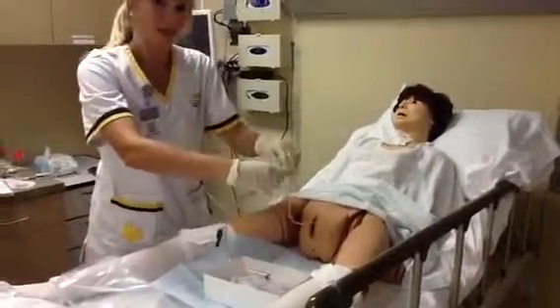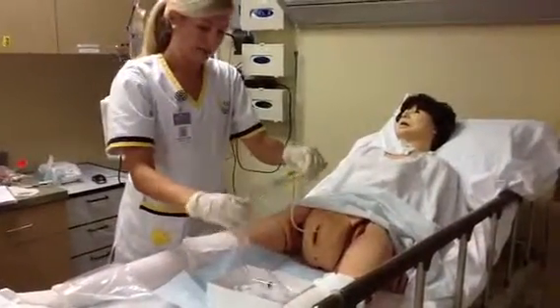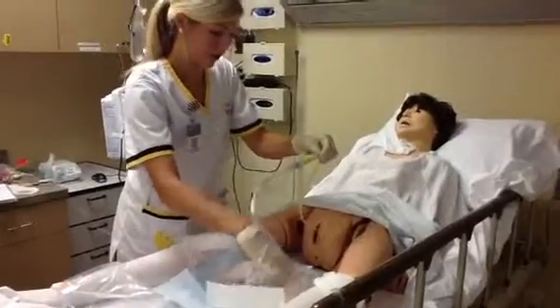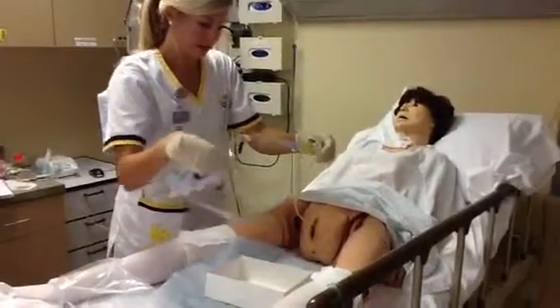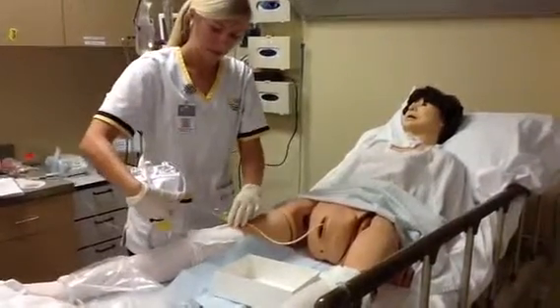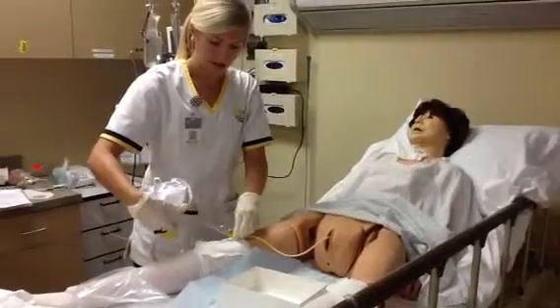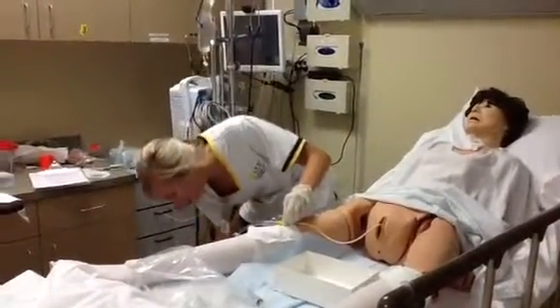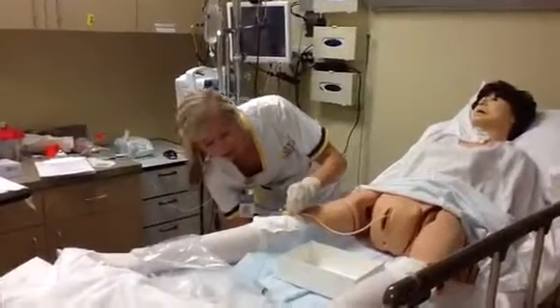And I'm now going to attach the catheter to her inner leg, and the bifurcation right here, not with tape, but with whatever came in the kit to secure it. I'm then going to lay this down on the side of the bed, and I'm going to hook it to the inside of the bed, not to the rail though, because I know that that will move.